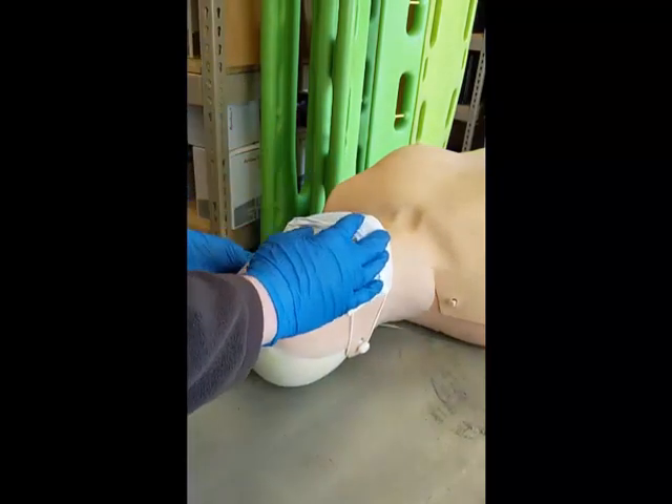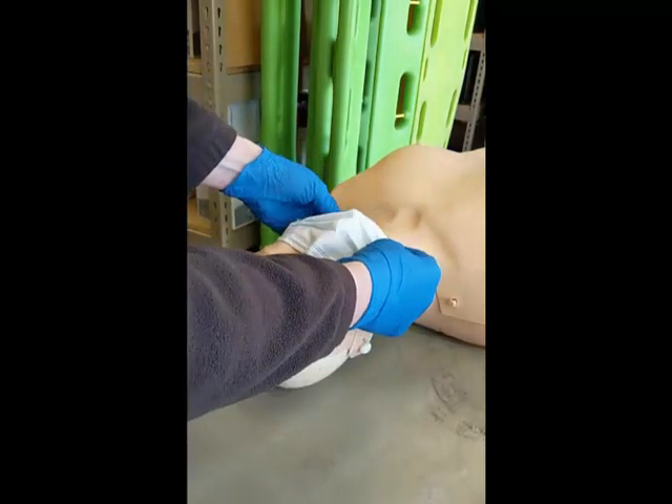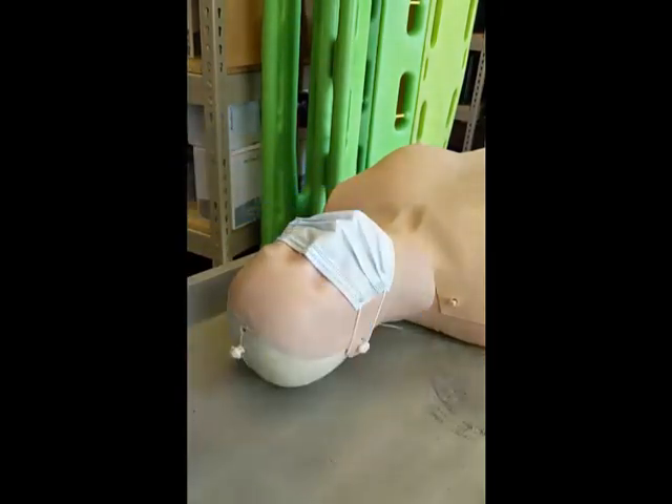Being sure to ensure the fit at the bridge of the nose and around the chin area. The next rescuer can immediately begin chest compressions, and we've already reduced or minimized the risk of aerosolization from secretions during that process.